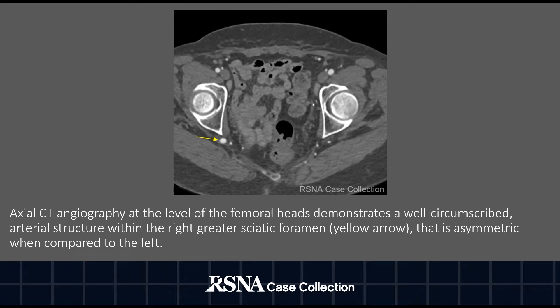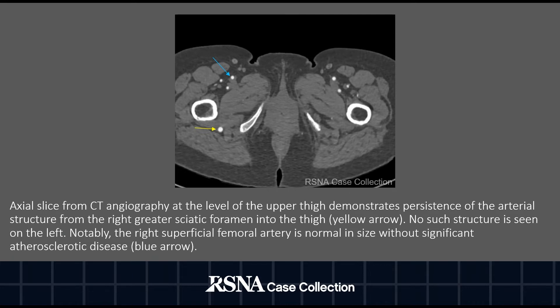Axial CT angiography at the level of the femoral heads demonstrates a well-circumscribed arterial structure within the right greater sciatic foramen, as indicated by the yellow arrow. The structure is asymmetric when compared to the left. An axial slice at the level of the upper thigh demonstrates persistence of the arterial structure from the right greater sciatic foramen into the thigh, as shown by the yellow arrow. No such structure is seen on the left.